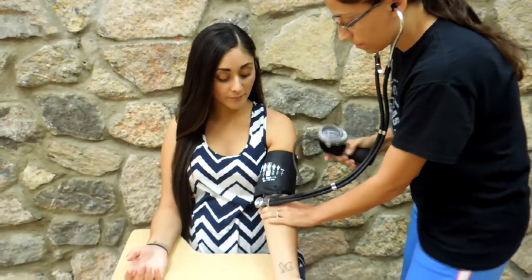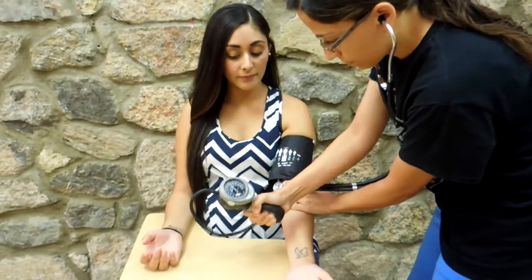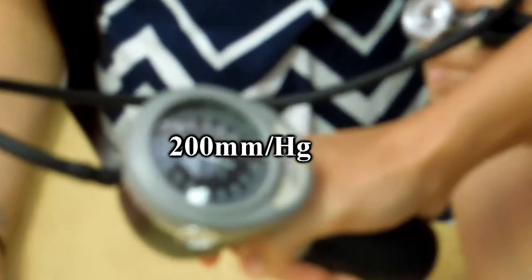Ensure that the air release valve is turned all the way to the right before pumping the inflation bulb. The cuff pressure must be inflated quickly to 20 mmHg above the first Korotkoff sound, if blood pressure is known, or to 200 mmHg.